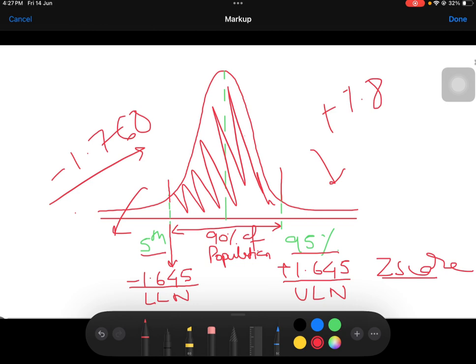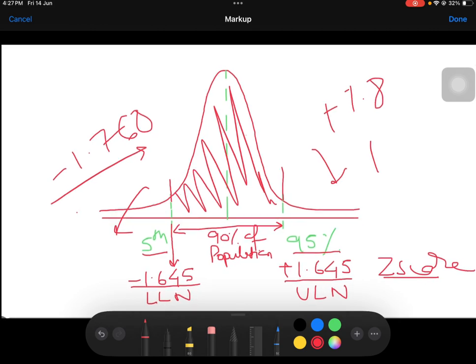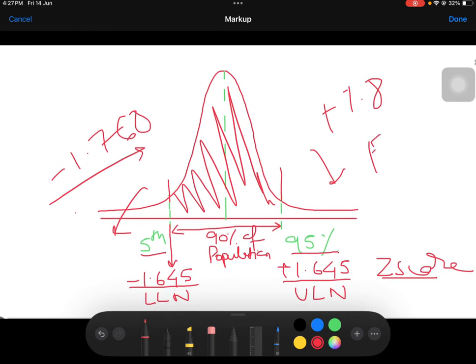Basically, in spirometry we measure the lung volumes such as FEV1, the FVC, and the FEV1 by FVC ratio. Now if the FEV1 Z score is more negative than minus 1.645, that is, it is less than the lower limit of normal. So like this, with every value we have to see the Z score.